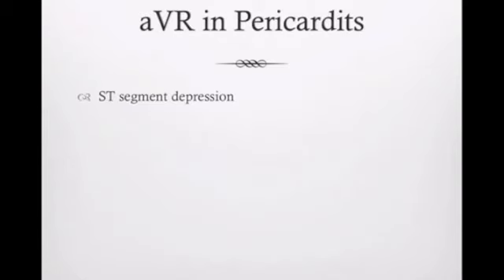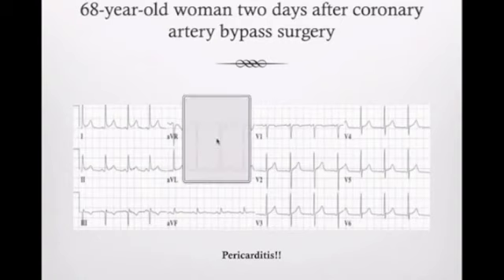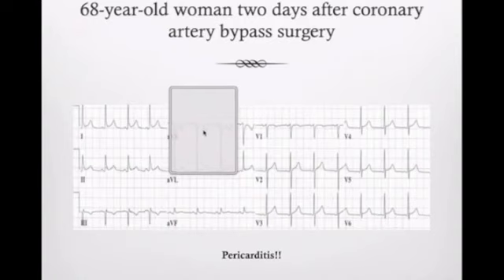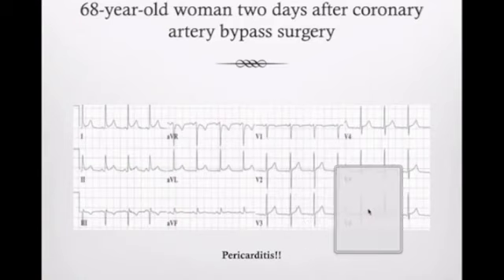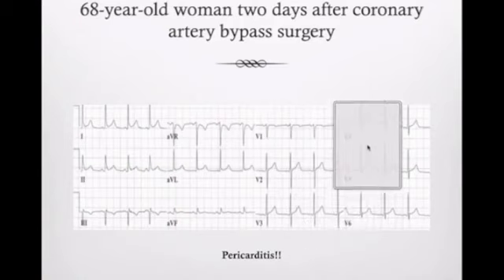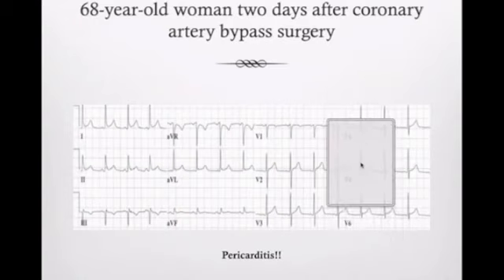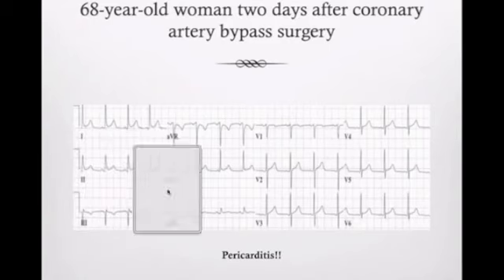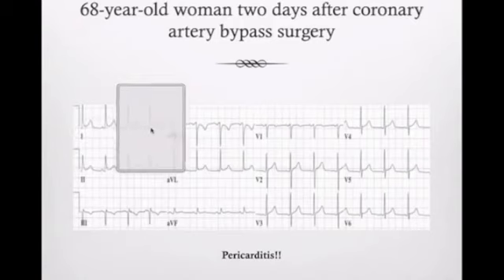All right? So going back to this EKG here, if we look, I'll blow that up. All right? We got PR changes. We have ST depression. Right? That could be pericarditis. Also, we noticed very minimal ST segment elevation throughout the entire precordium. Right? And a very narrow J point to my R wave, which is also a nice sign of pericarditis. We also see PR segment depression here in 2. We also see it a little bit here in AVF. We also see it a little bit here in 1. All those are signs of pericarditis.